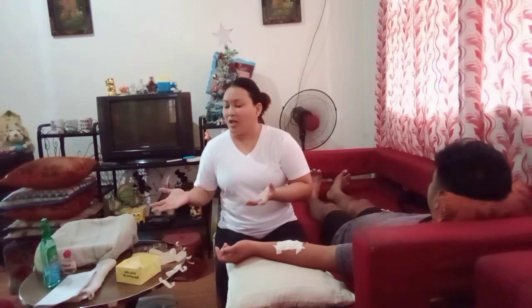Good morning, everyone. I am Krishna Cansivia Flores, and today I'm going to demonstrate wound care. So let's start. The first thing that I will be doing is to show you the needed equipment.